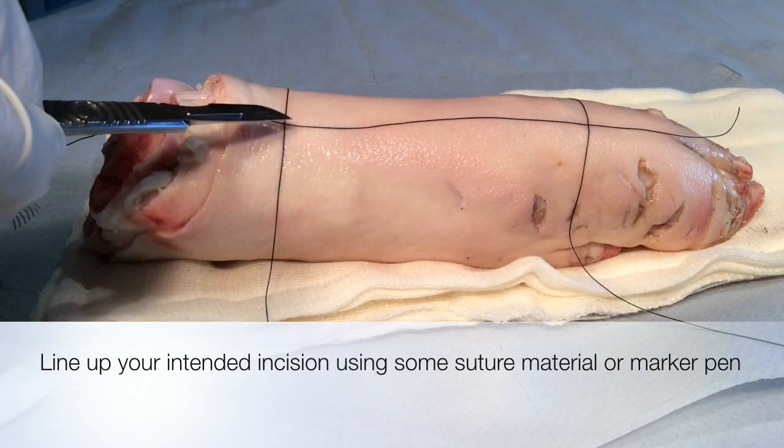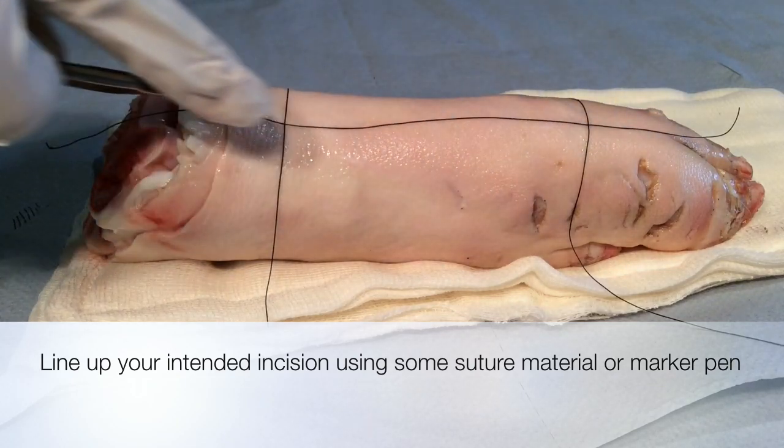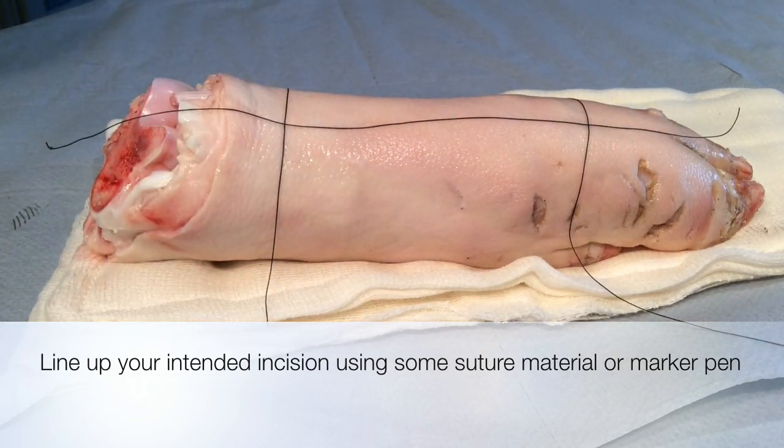Starting and stopping landmarks have been lined out using suture material to help guide my incision. You can use marker pen if this is available.